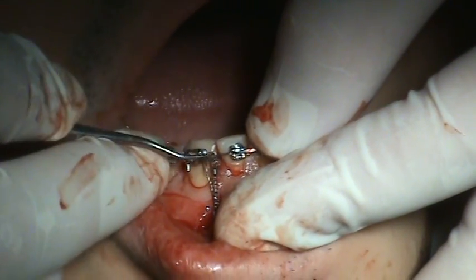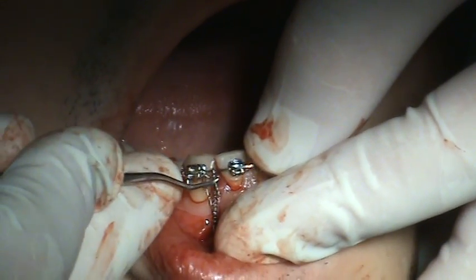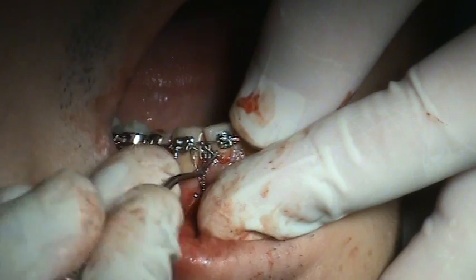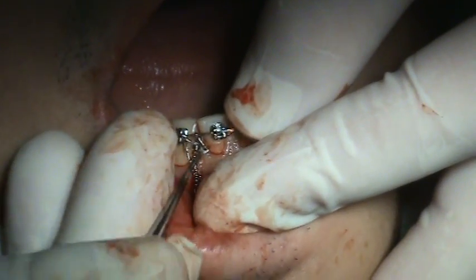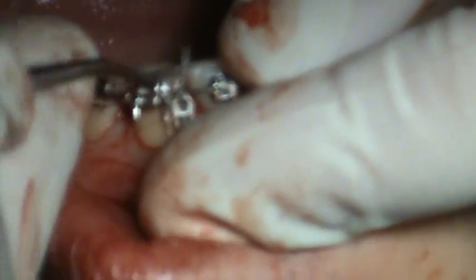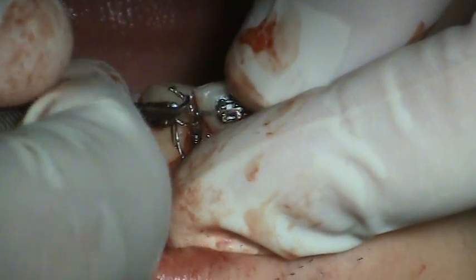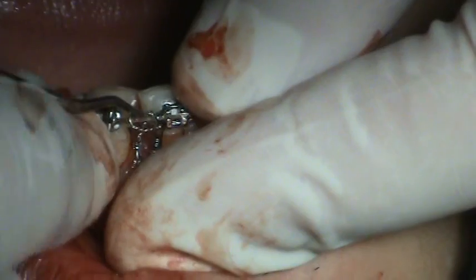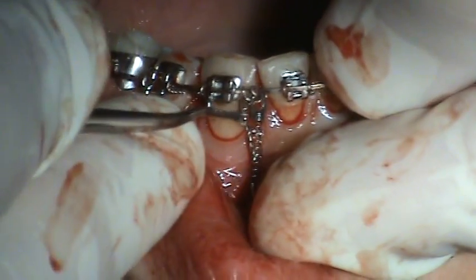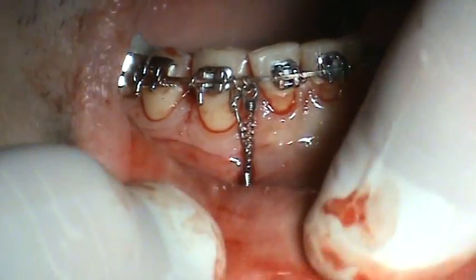We used to have to check the force on this, but since we know, on a six millimeter coil it's a standardized thing now. Two millimeter activation is a hundred and fifty grams. That's pretty clean, and we don't have to suture that.